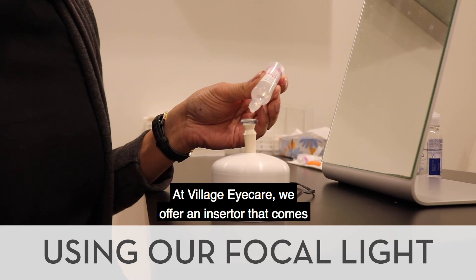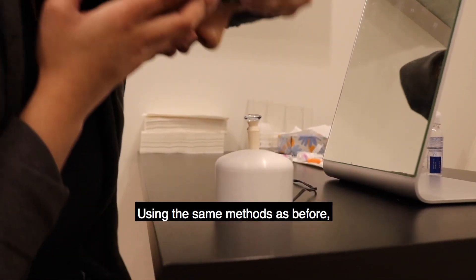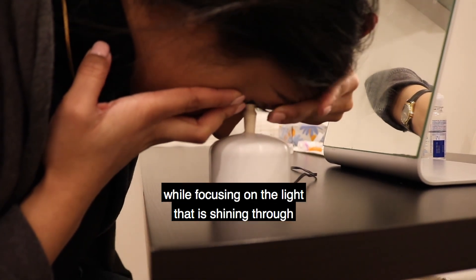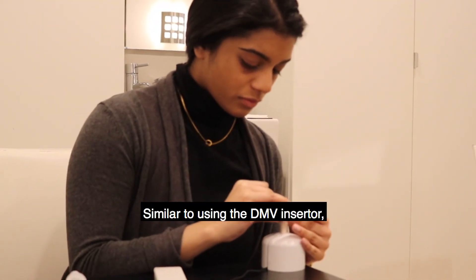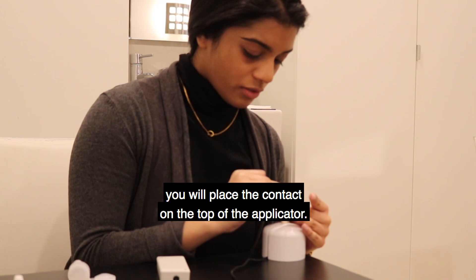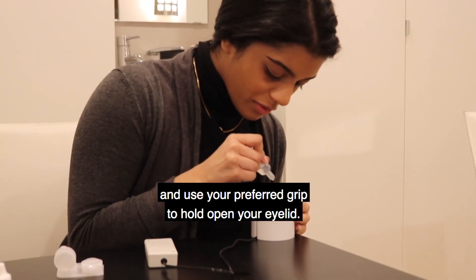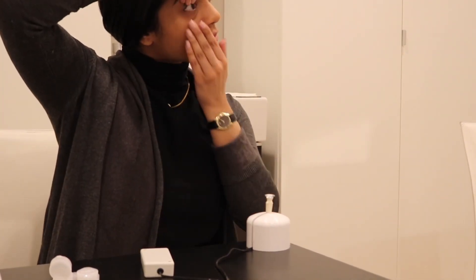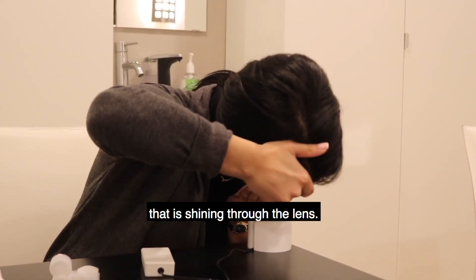At Village Eye Care, we offer an inserter that comes with a focal light for easier insertions. Using the same methods as before, you will lower your head to the inserter while focusing on the light that is shining through the center of the lens. Similar to using the DMV inserter, you will place the contact on top of the applicator. Fill the bowl with your saline solution and use your preferred grip to hold open your eyelid. When ready, bring your head down to the inserter while focusing on the light that is shining through the lens.